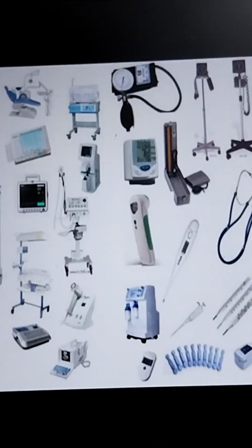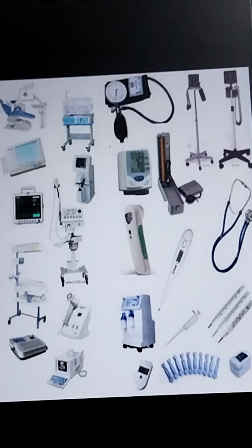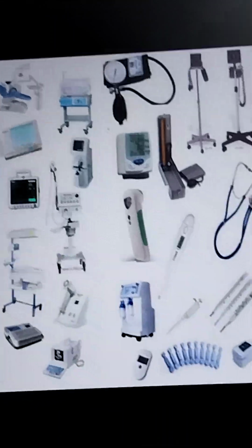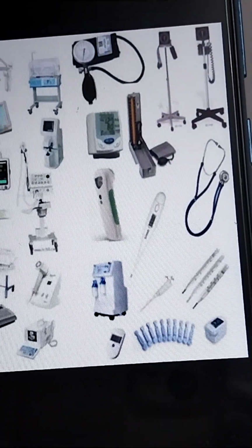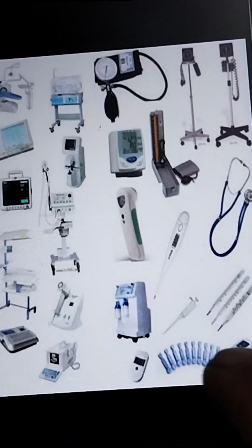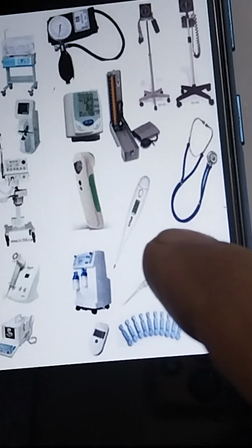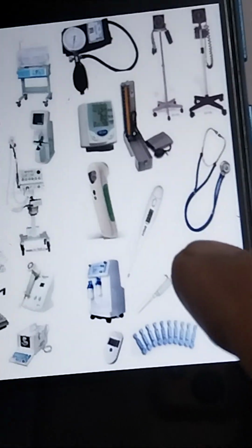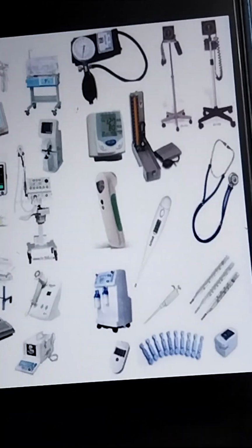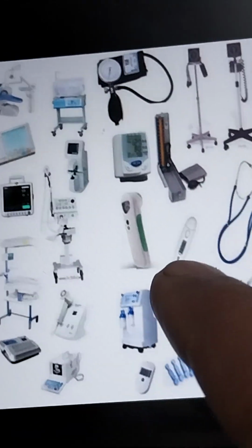Unfortunately, no government has set a rule or a standard for the safety of medical instruments. Any test and inspection regime intended to minimize the electrical risk from medical electrical equipment should take into account the likely degree of risk from electrical hazards compared to other hazards of medical equipment. For this reason, various hazards associated with medical electrical equipment are as below.